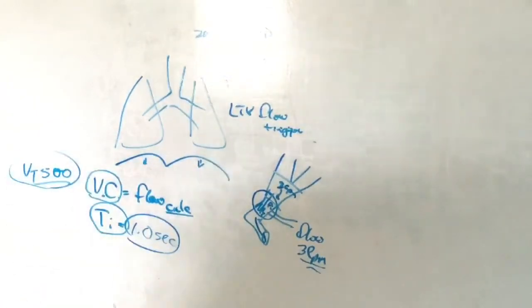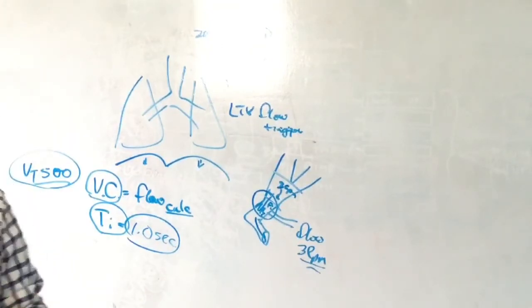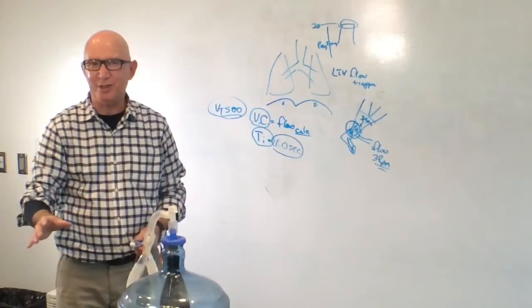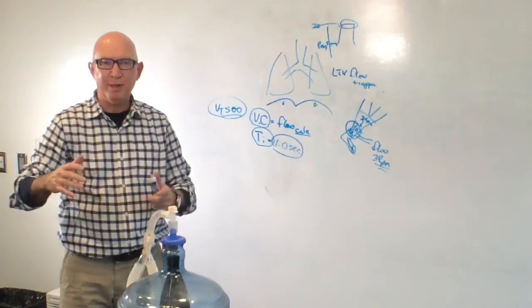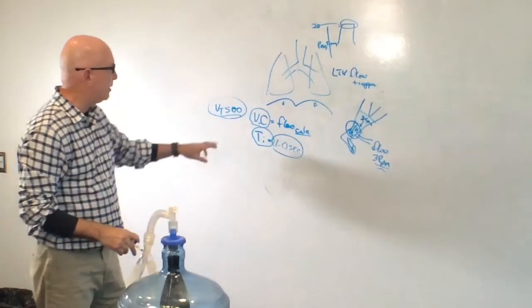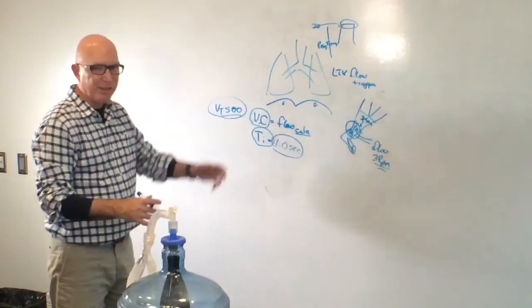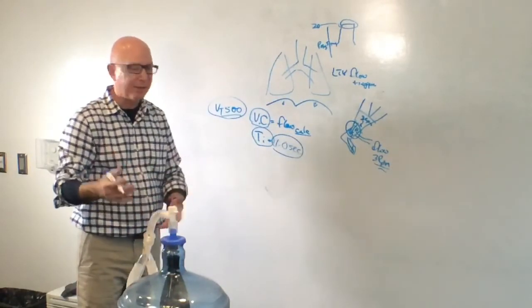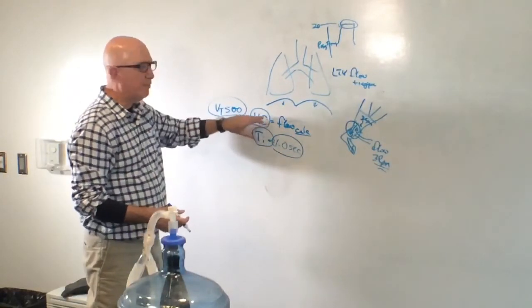Whereas other ventilators which cost more and are, so I was going to use the word sophisticated. I don't want you to think that the LTV is a dinosaur. That's not my point at all in saying this. It's an extremely robust ventilator and does a great job for almost everything that we need, but there are some limitations to it, and this is one of them. Most ventilators on the market can disassociate volume and flow and time, so you can adjust those parameters independent of each other, and therefore you can titrate a few things for your patient.